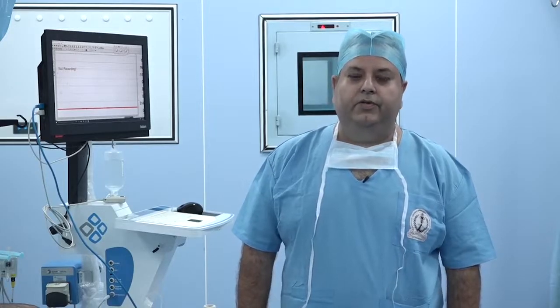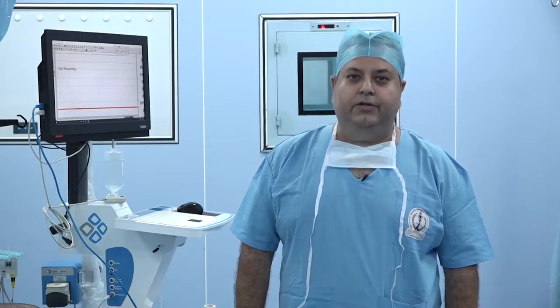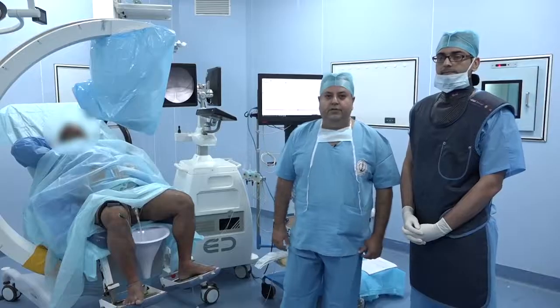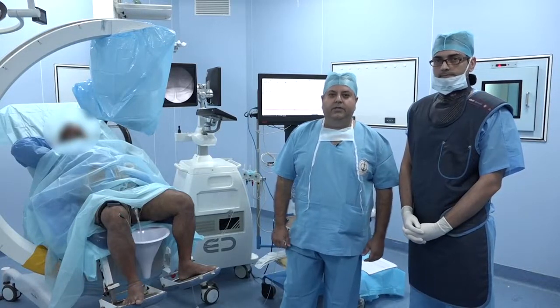I am Professor Pawan Vasudeva. We shall be doing urodynamic studies in patients with neurological diseases who have urological problems today. So this is our first patient, and Dr. Vijay, who's a resident, will assist me in this case.